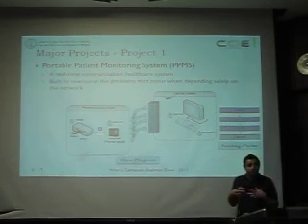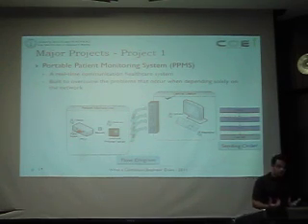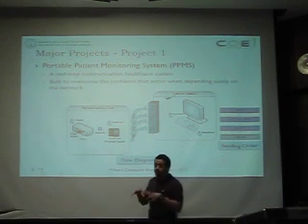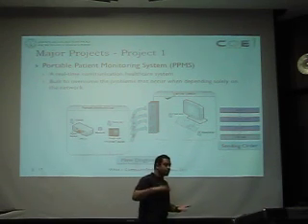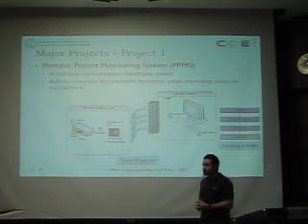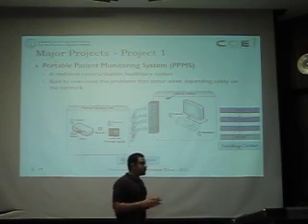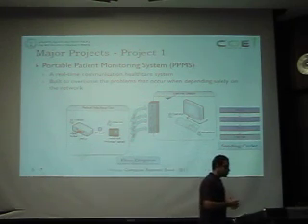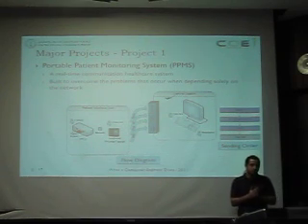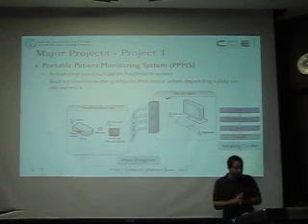It can be at homes, because this is portable, and you can install the patient interface unit on the bed of the patient, and then you can connect or configure the patient interface unit to communicate with the central station, and then you can have a full system working for you. This is, of course, a proof of concept project we did in advanced electronics company, and alhamdulillah, we've successfully managed to prove the concept.